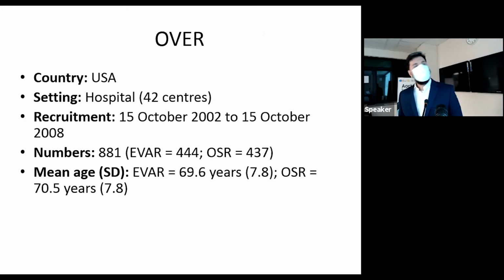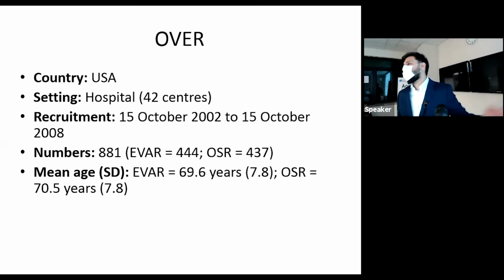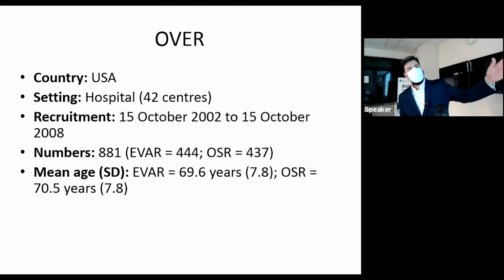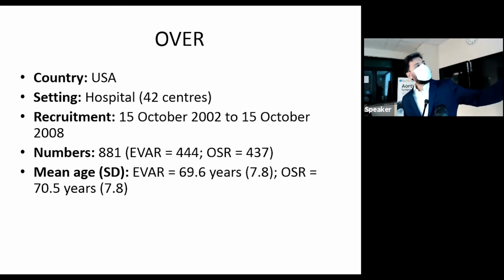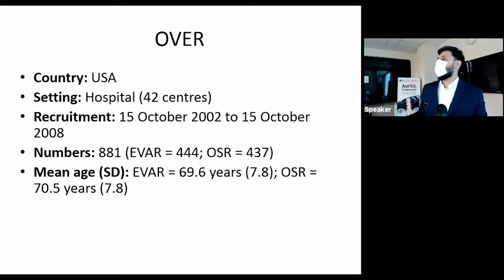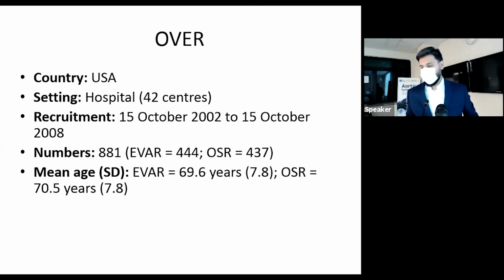And the interesting thing to note here is the dates of when these trials are occurring. The EVAR-1 trial is really quite old now, and this is, of all the trials I'm going to talk about, probably one of the most recent ones, from 2002 to 2008. So that's something to bear in mind, because obviously the expertise and the hardware have evolved since then. I'll touch upon that in a few minutes.